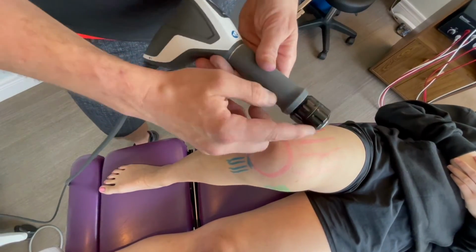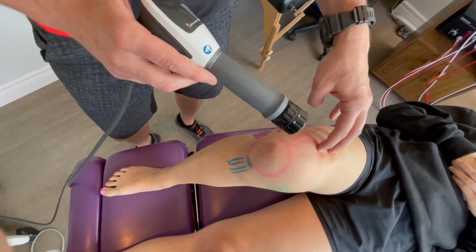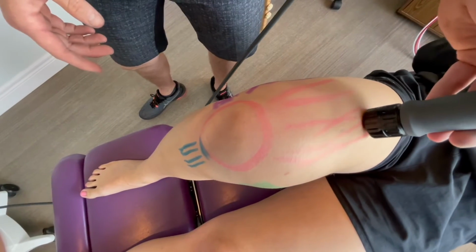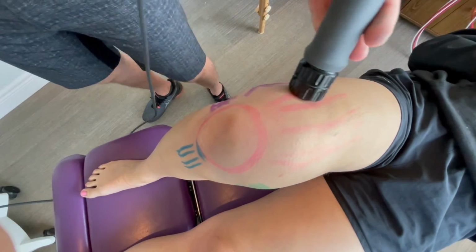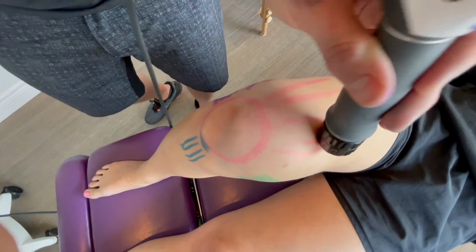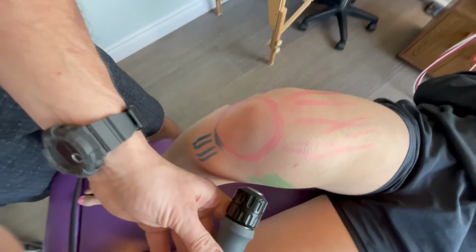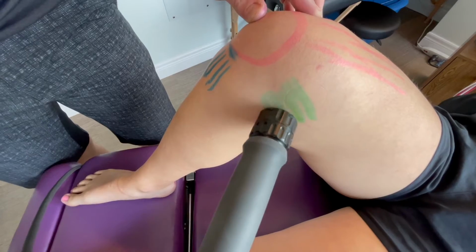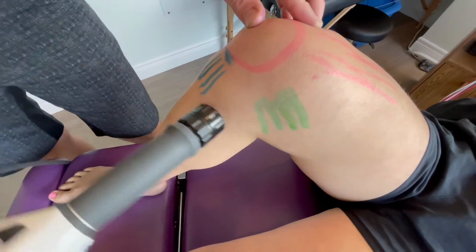So as the bolt in a tube hits here, we go into the areas of injury. If it was a quad injury, we would run the gun all the way up and get it all through here, 800 to 1,200 hits. In the meniscus, we would come on the inside. I would work the meniscus over pretty hard, trying to find the place where the patient has the most pain, and we work from there.